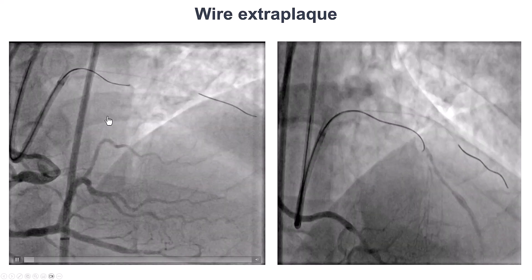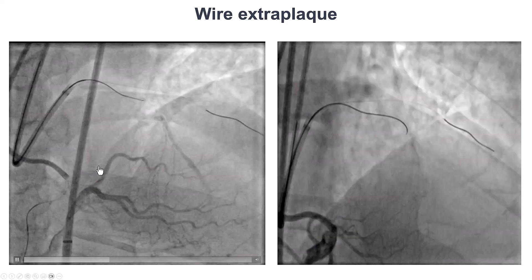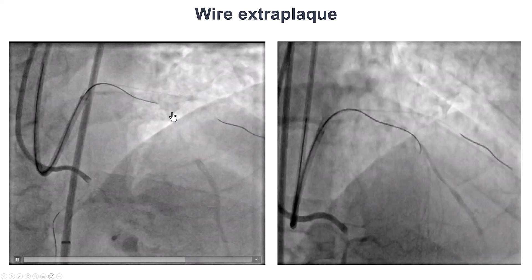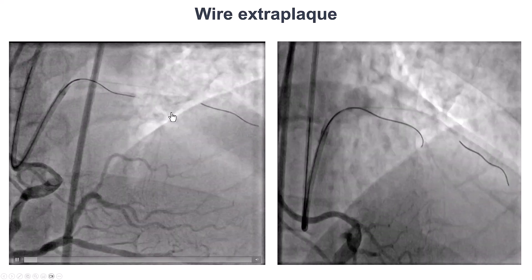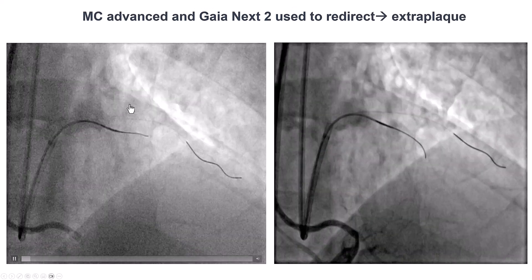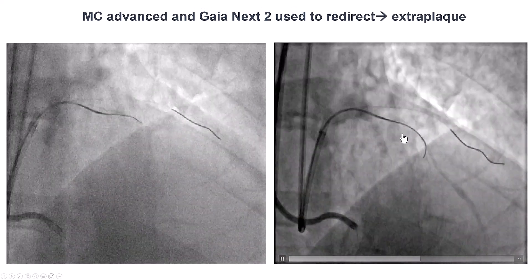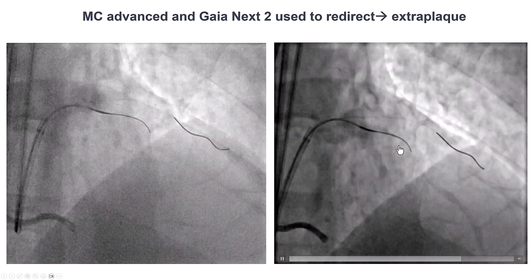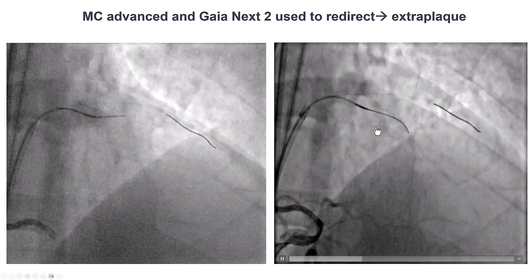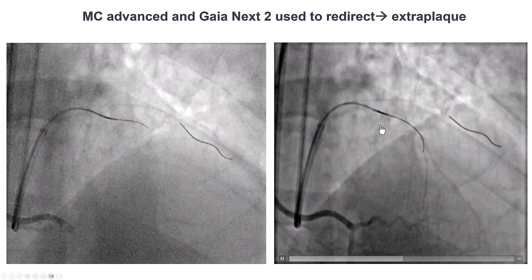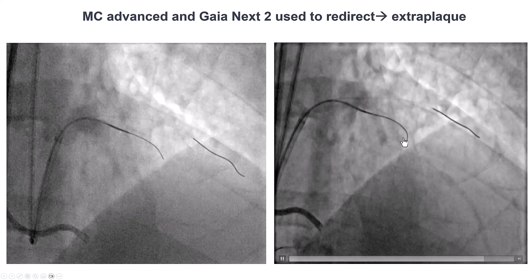Unfortunately, as we see from right coronary injection, the wire is in the extraluminal position. We did a brief attempt to try to redirect the guidewire, but it remained extraluminal. Based on our original plan, we decided to switch to the retrograde approach at this point.